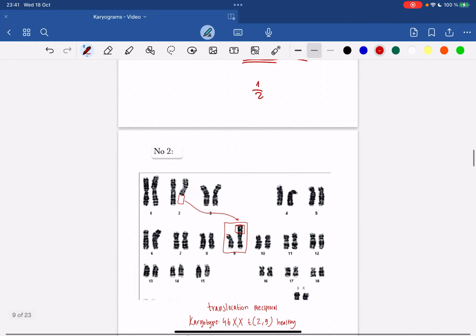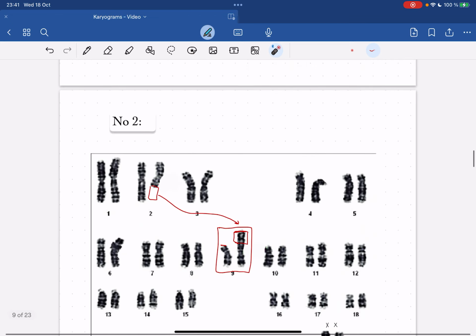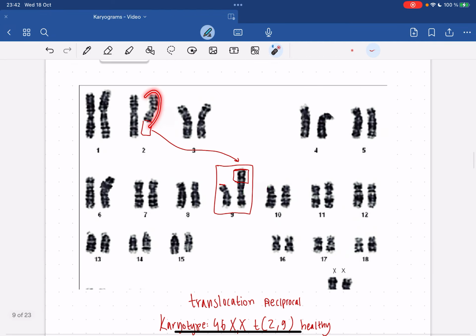Number 4 is the opposite of this. So in this case, we would take this chromosome that is abnormal and this chromosome that is normal. And because we have a normal chromosome here and then we have an abnormal here, we only really need this, but we have this inserted. This is an additional piece. That means that there has been an insertion here and we can't compensate it with the lack of something here because we're choosing this instead of this. This one is out of the picture now, which we've chose this and this, right?